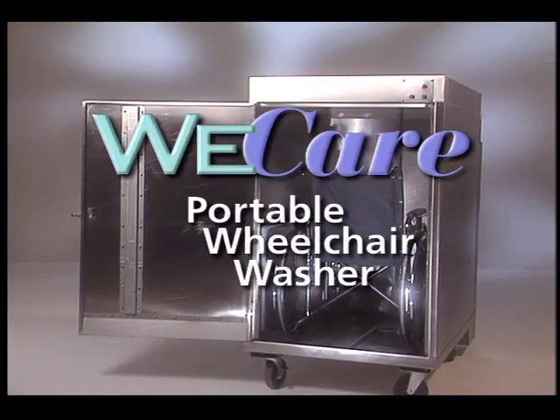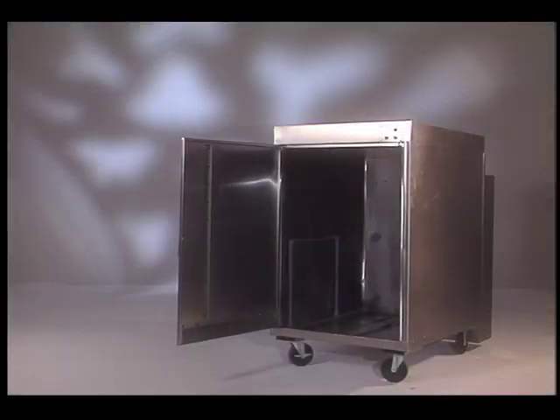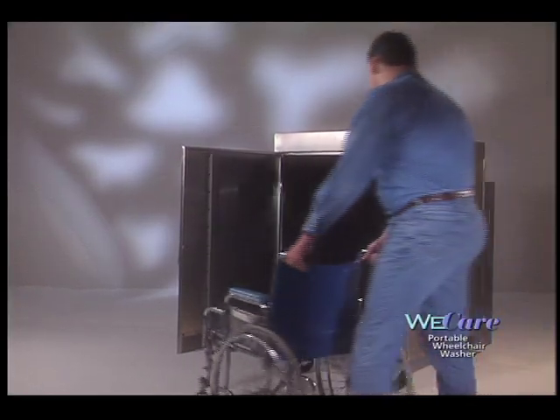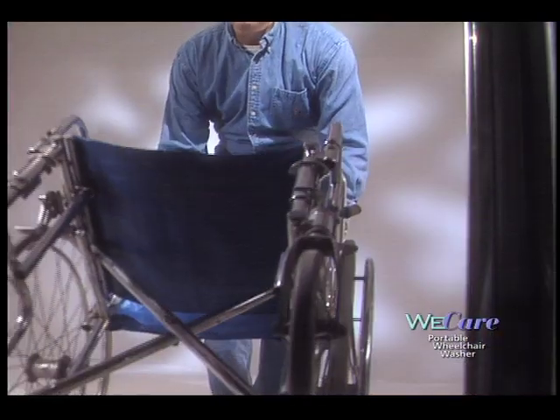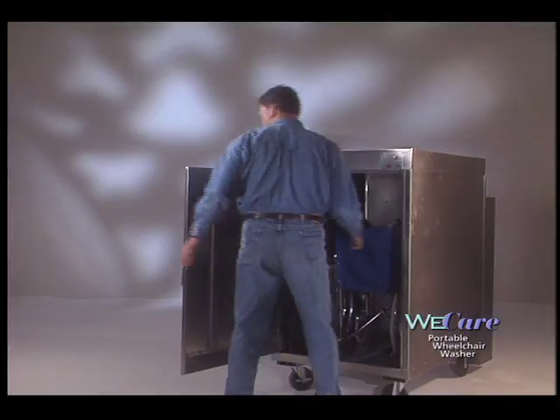Introducing the new WeCare Portable Wheelchair Washer. Washing and disinfecting wheelchairs is a lot like washing and waxing your car. If you had to manually wash and wax your car twice a month, it probably wouldn't get done.